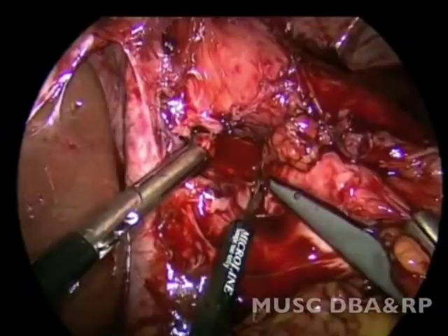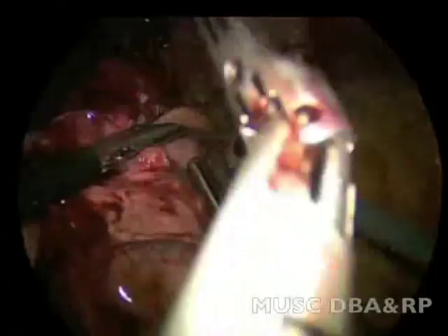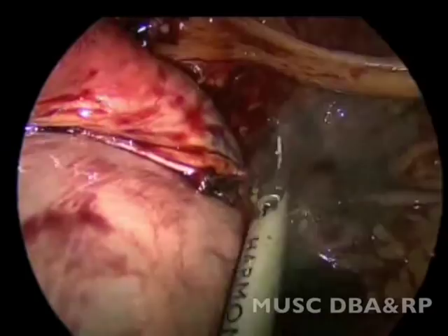The short gastric vessels appear not to have been taken down in the initial operation. These are now ligated with a harmonic scalpel and the greater curvature is freed on the left side all the way up, exposing the left crus of the diaphragm.